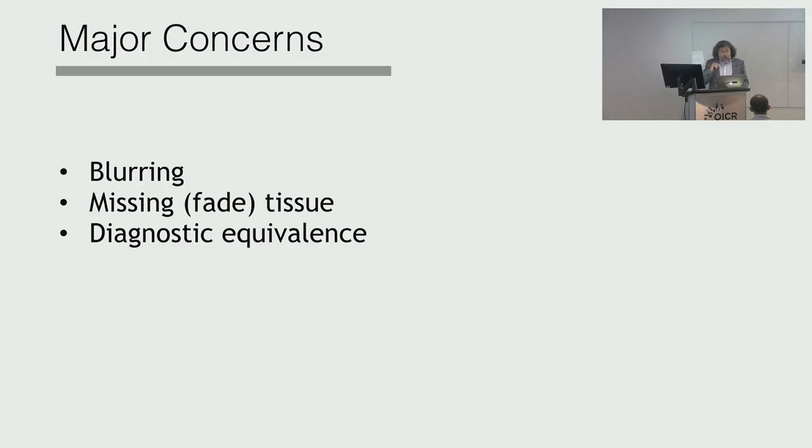But in digital pathology, we don't know. And if the tissue sample is not even, then you may lose focus and things get blurry. And there was just recently a paper on the effect of blurry fragments of the specimen on diagnosis. Very serious issue, especially for rare cases where you may have something in a really tiny part of the glass slide being 100,000 by 100,000 pixels.